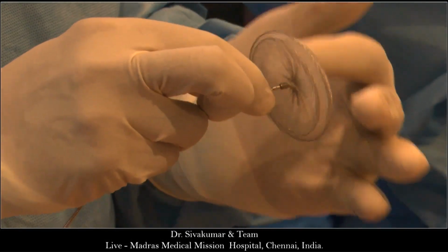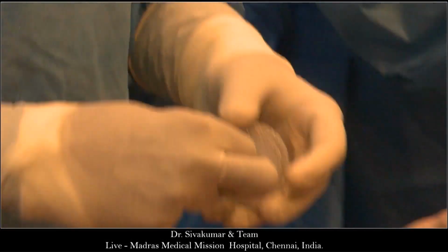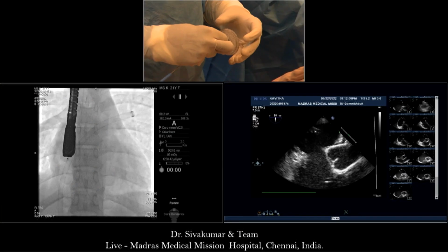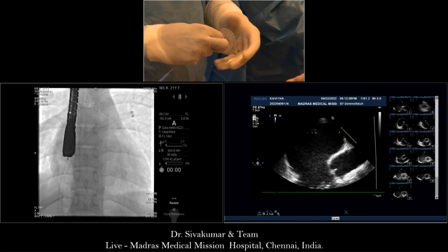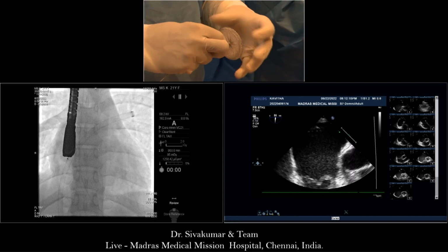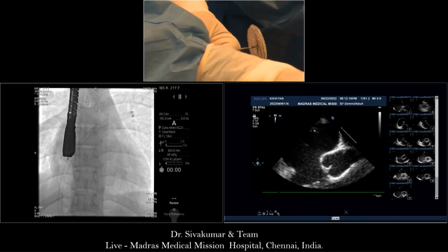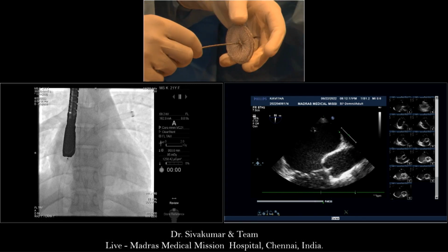Whatever she sees, right? So you see IVC, right? Show the echo. So we're not going to get the answer so far. 27 and 31 are the two dimensions we've got. You want a third one? We can't. Bicaval, they can't see on the bicaval. That's the problem. Did you measure bicaval view? There was no defect on bicaval.